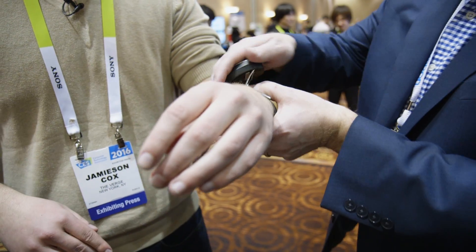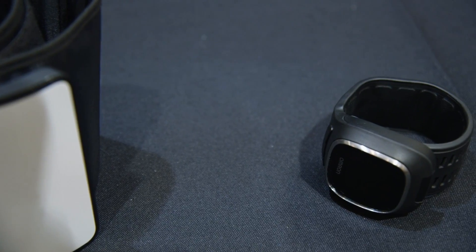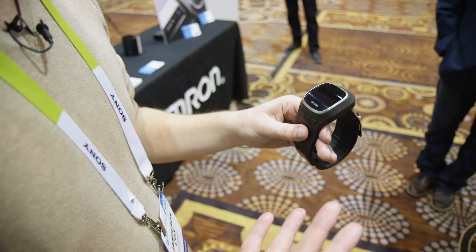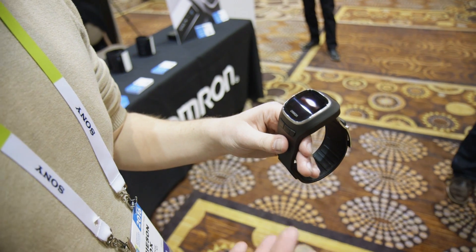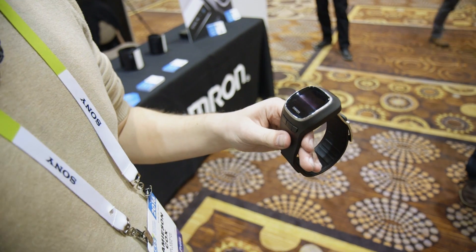Omron isn't looking to gamify blood pressure monitoring in any way or make any sort of diagnoses. It's just intended to be a tool that makes it easier for you to keep track of your blood pressure on a day-to-day basis if it's something you're struggling with and to monitor that condition.